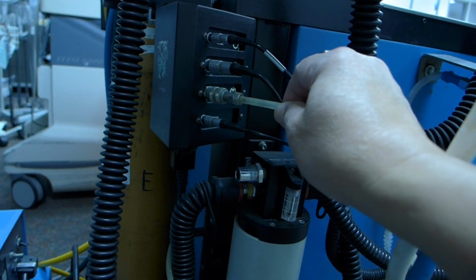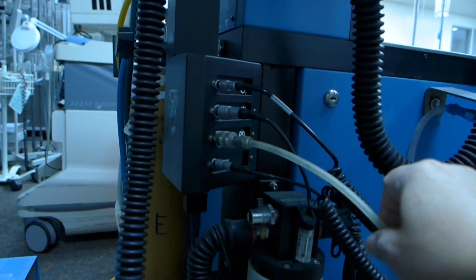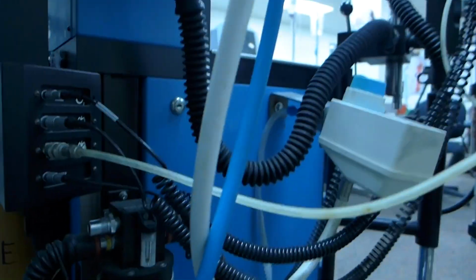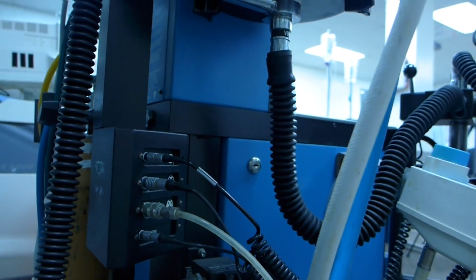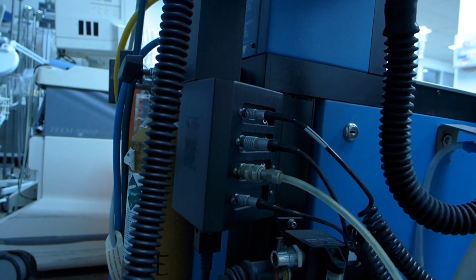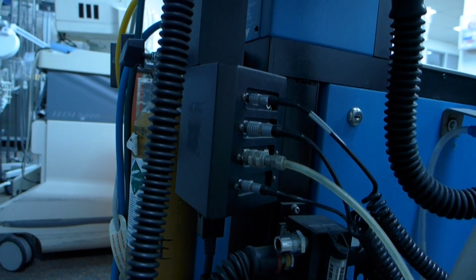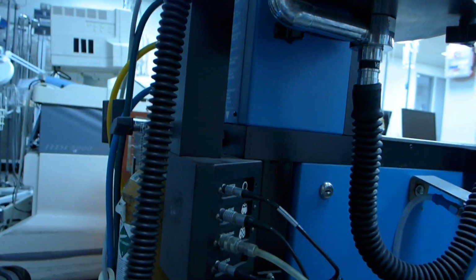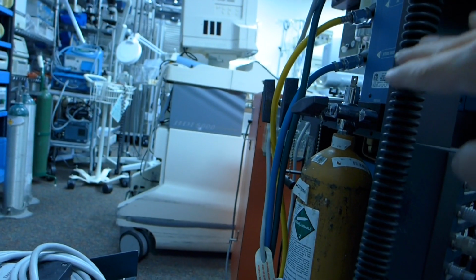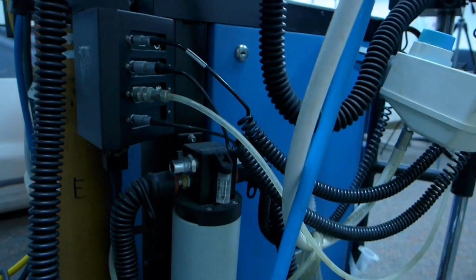This is very, very critical because all the alarms, the low pressure alarm on the breathing circuit, come from this line here. So we have to make sure this is connected at all times. Basically, this is like a valve. It acts like an expiratory valve, and the inside valve here allows it to open and dump the anesthesia waste gas out of that bellows system.